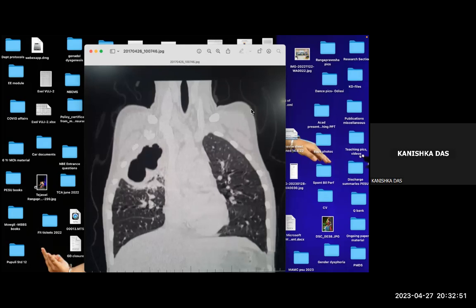I am not seeing any adjacent parenchyma nearby. Then in the middle, right side, you have the middle lobe. In the middle lobe, there is some adjacent consolidation sort of picture which is seen. The lower part looks normal. So I would complete all this and then say my differential diagnosis. So a thick walled, almost single loculus, etc., peripherally placed, not towards airway. So what would the differential diagnosis be? We have not given you any more information. Suppose I give you some more information, then you can base it on that information.